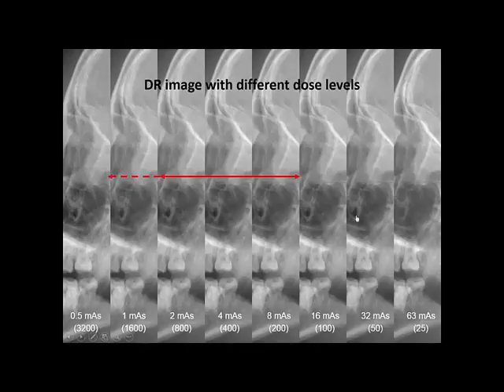What changes on DR is the noise level depending on the dose, and the noise is too high if, in white areas like here, the noise gets too high for the radiologist, and he would say something like the image is too grainy. Also the dose can be too high, and we come to this discussion in a minute.